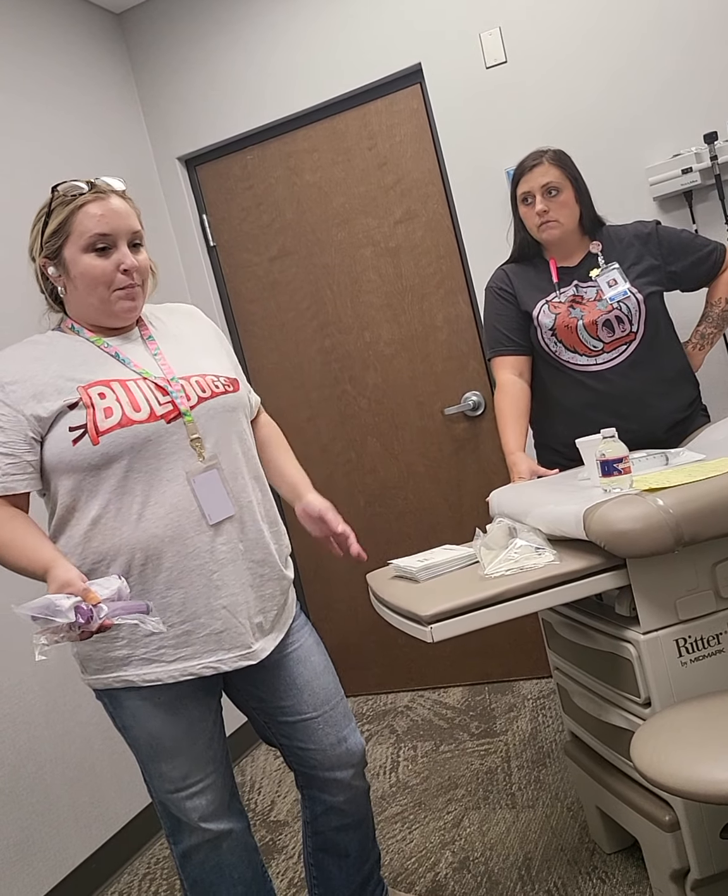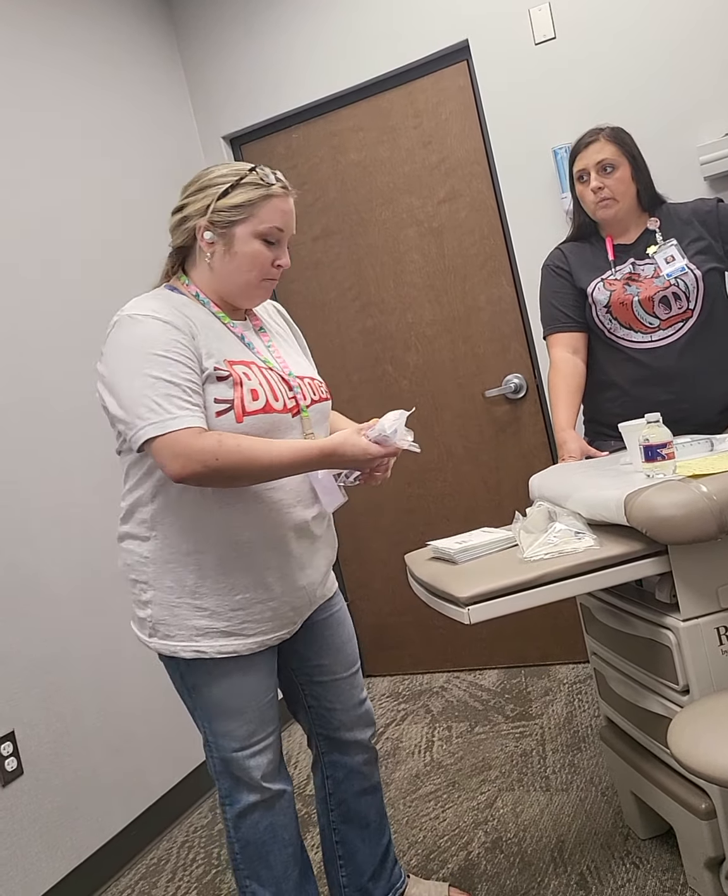Sponges, gauze, and some tape. These are things that will be sent to you along with syringes and eventually a tube feeding formula when I set you up with one of the companies that they normally set you up with when you get it.